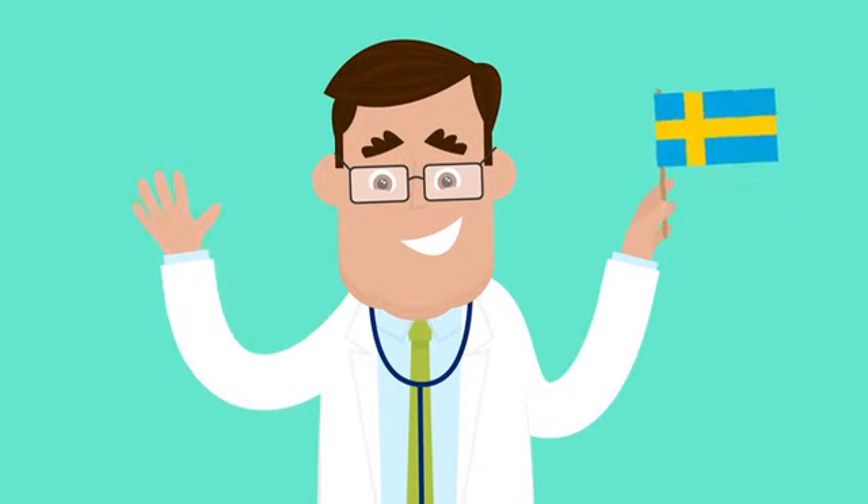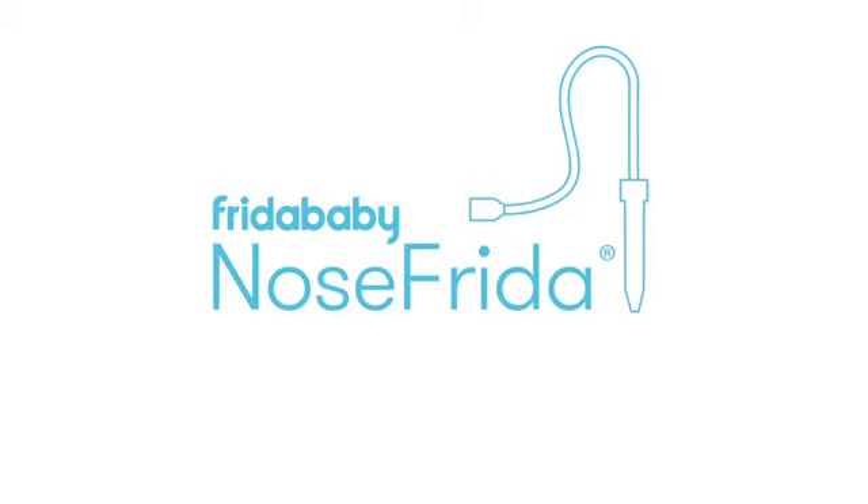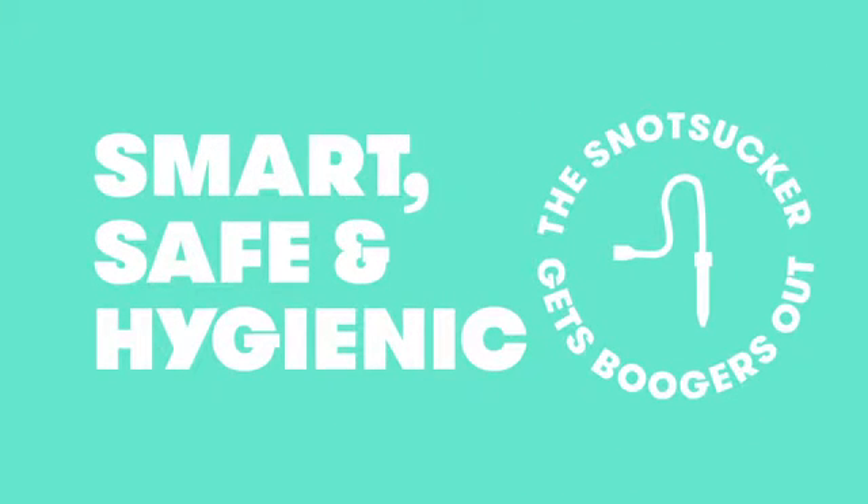Invented by a Swedish pediatric ear, nose, and throat doctor, Nose Frida, the snot sucker, is smart, safe, and hygienic snot sucking.